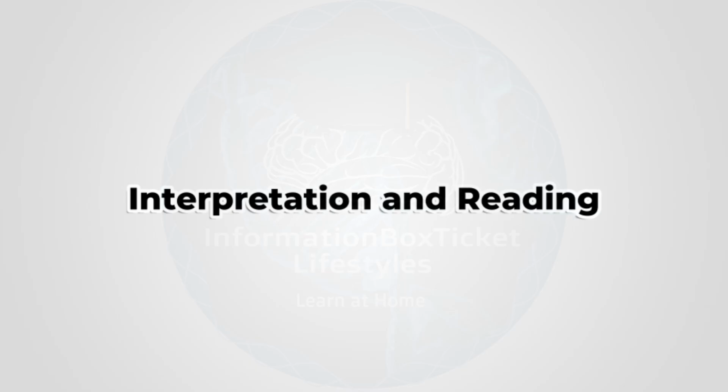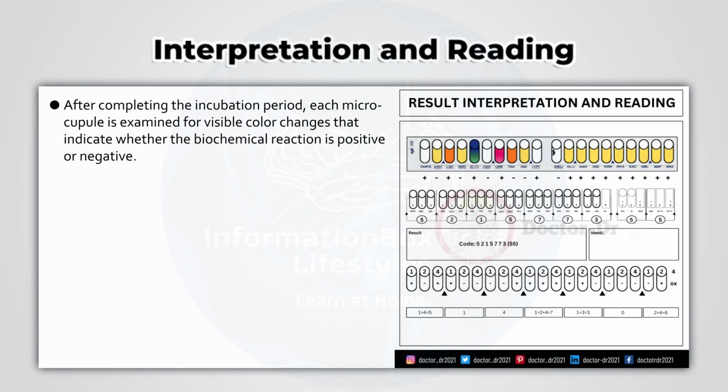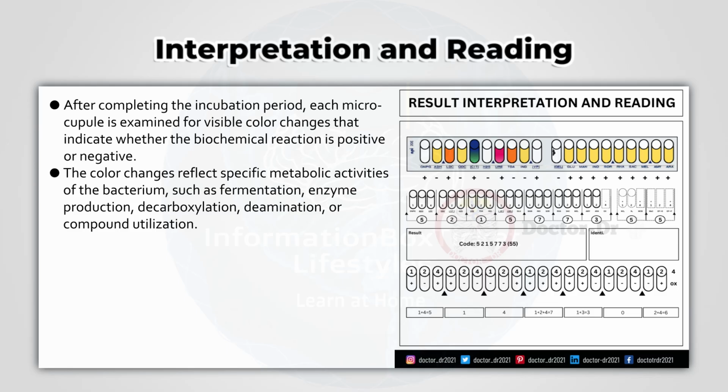Interpretation and reading. After completing the incubation period, each microcupule is examined for visible color changes that indicate whether the biochemical reaction is positive or negative. The color changes reflect specific metabolic activities of the bacterium, such as fermentation, enzyme production, decarboxylation, deamination, or compound utilization.